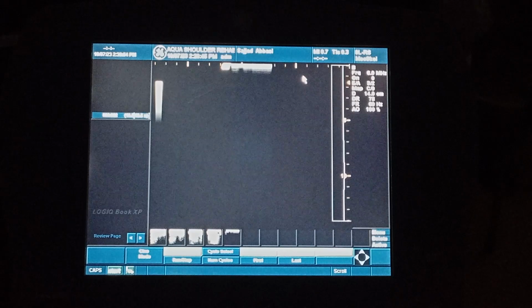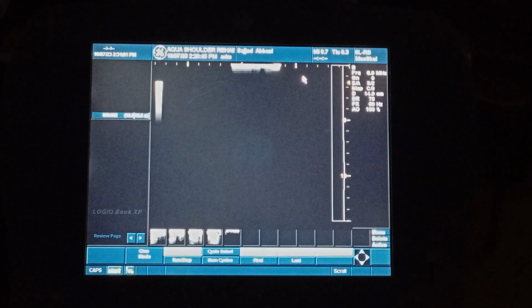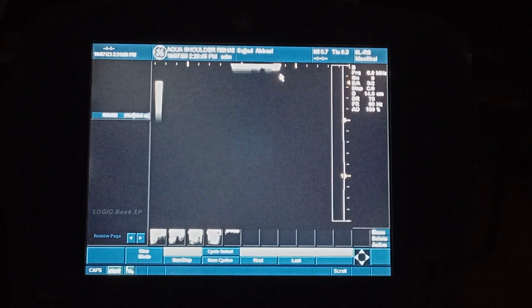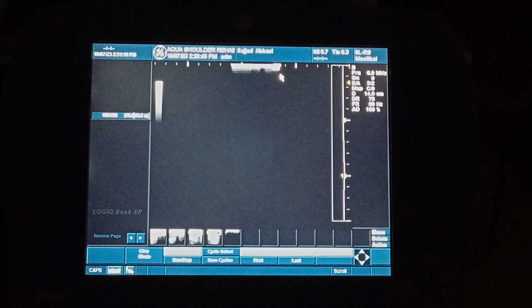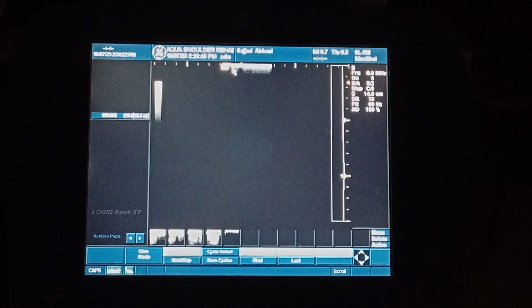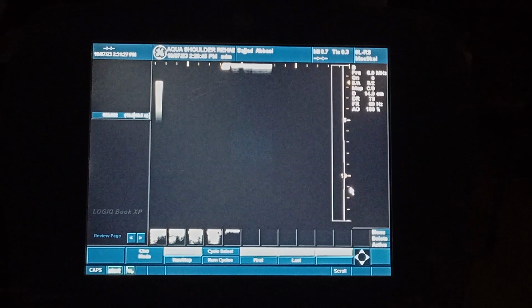So you can make use of it by making it medial or lateral. You can also change it. For example, I want to reverse the marker. Now the GE is moved to the right side. Over the screen you can see this GE has moved to the right side. This means your marker should now be on the right of the patient if you want to see the right side. And when you know the right and left, you can easily work out what is medial and what is lateral. You can also reverse this to the opposite side. So this is the x-axis and this is the y-axis.